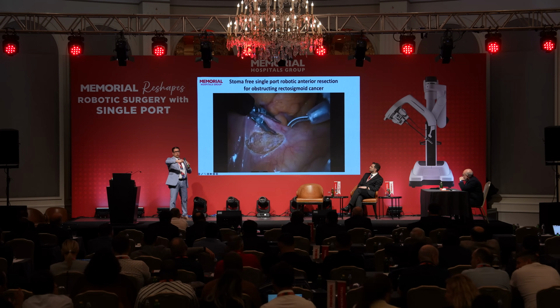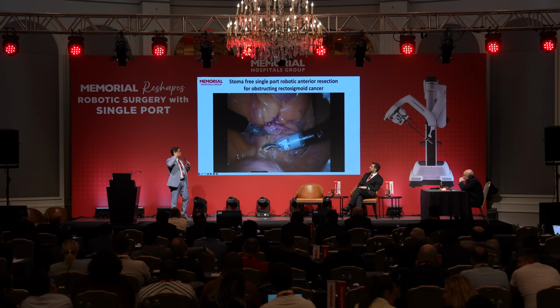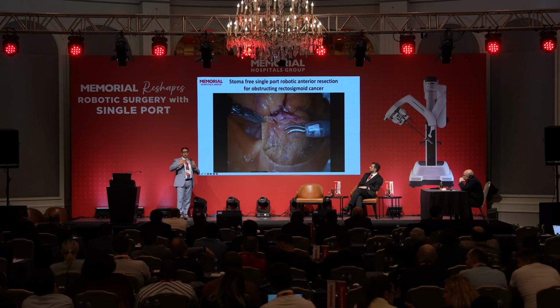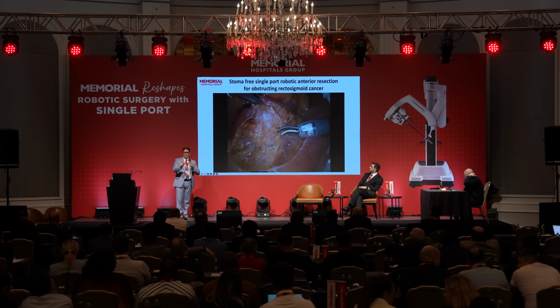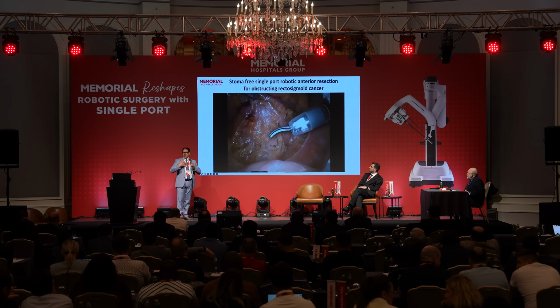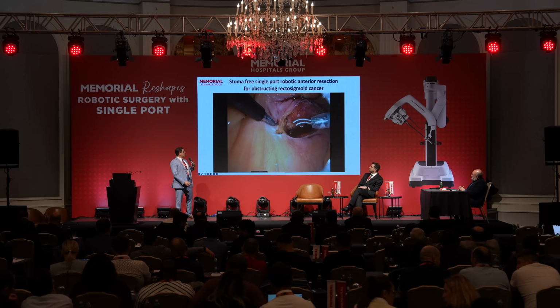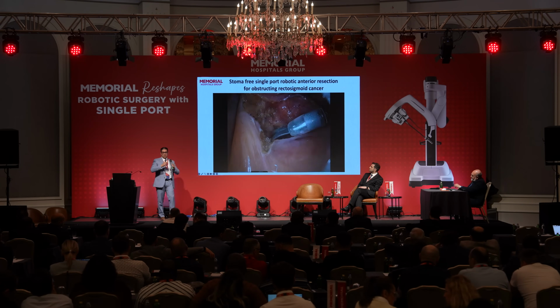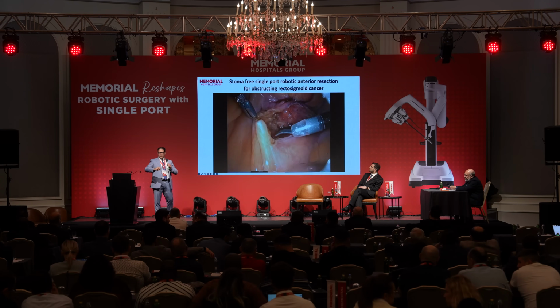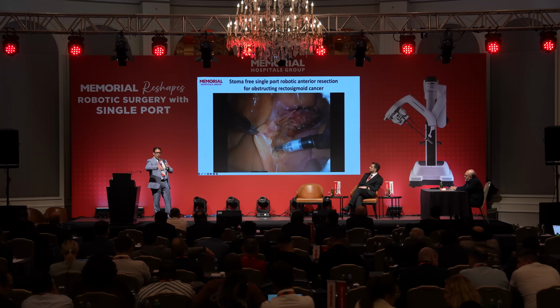Look here how it is working, the crab hand. And he can never do one straight line like you do with the Xi. This is something you have to recognize, especially with colorectal. Unlike any other small organ, where 2 centimeters is enough to dissect the vessel, for us you need more than 15 centimeters to get everything mobilized. So you can see he's doing snip, snip, snip, compensating for the difference between a straight instrument with a 3D tip versus an elbowed instrument with a 3D tip.